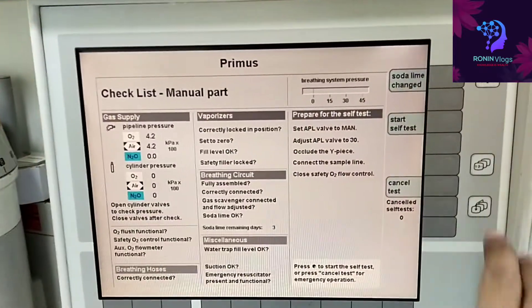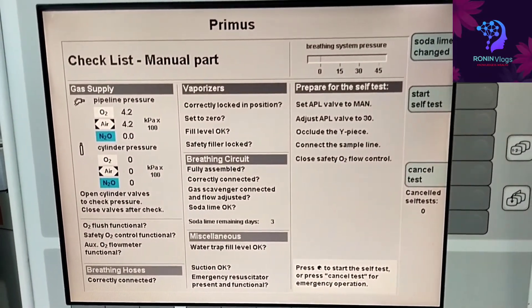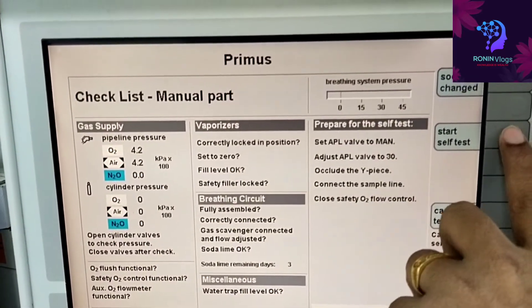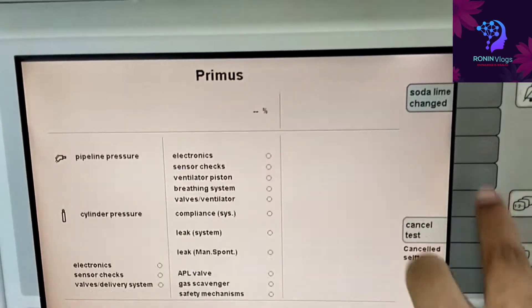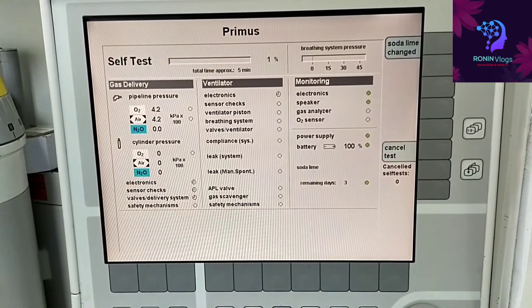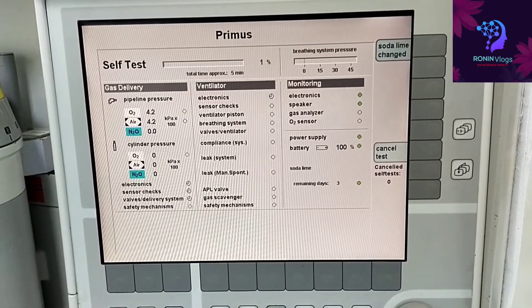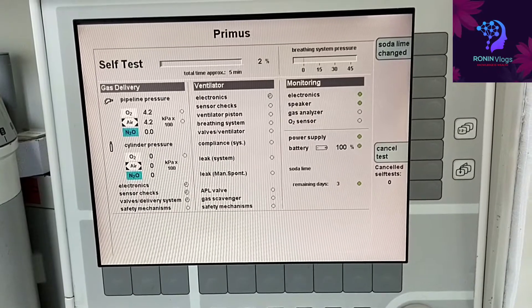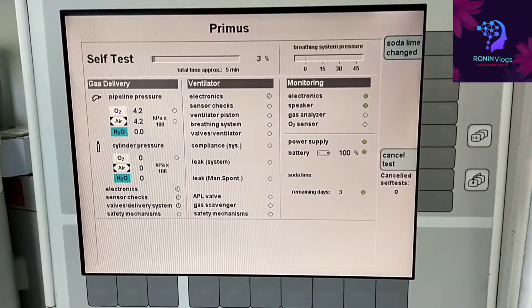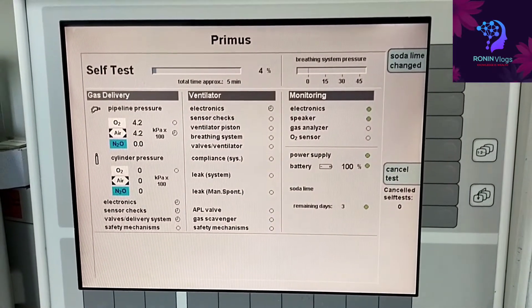This is the checklist of what things are going to be covered in the self-test. The side buttons available are: soda lime change, start. We need to press start self-test; if we need to cancel, we can press cancel test. The three main parameters being checked are: gas delivery, ventilator, and monitoring — these are the three areas the self-test covers. Note that we have not connected the cylinder.